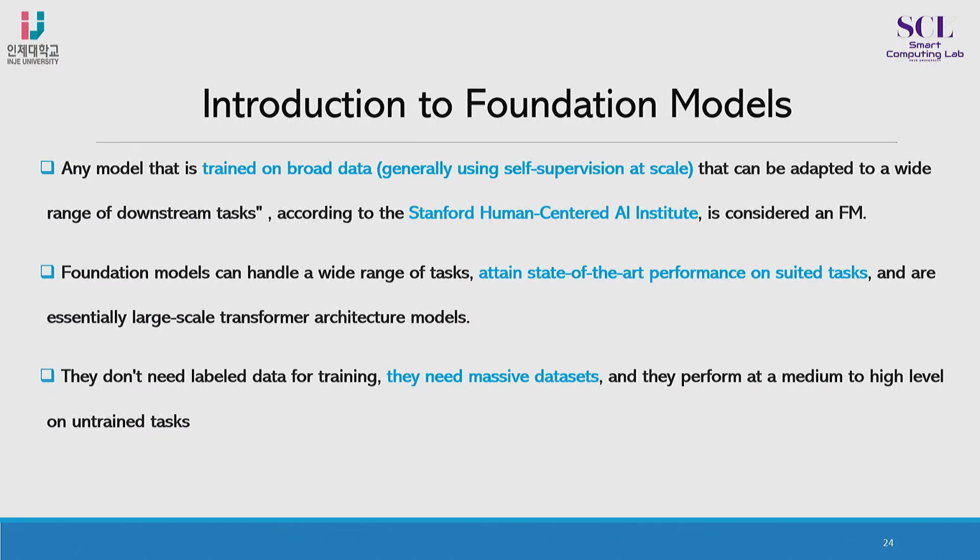So coming to the foundation model, what is a foundation model? Actually, a foundation model is a kind of technique in AI in which we use self-supervised learning, and we use a plethora of data. A massive amount of data is needed to develop a foundation model. It doesn't need any kind of labeling of the data. We just give the data to the model, and the model itself learns the intrinsic features, and it categorizes different kinds of objects by itself.